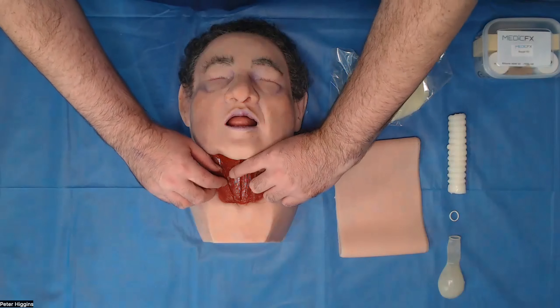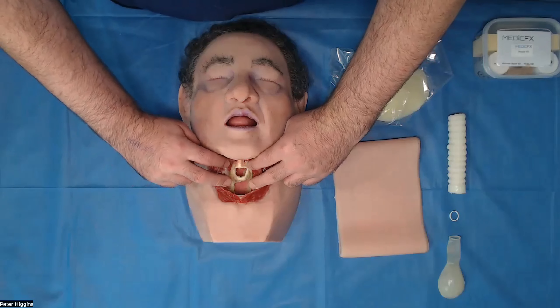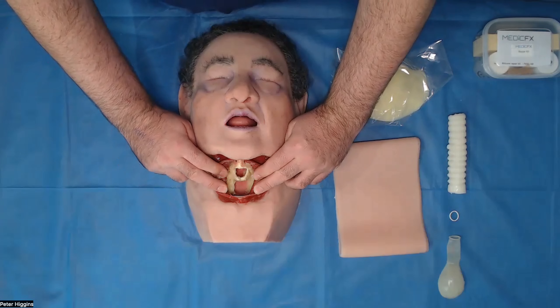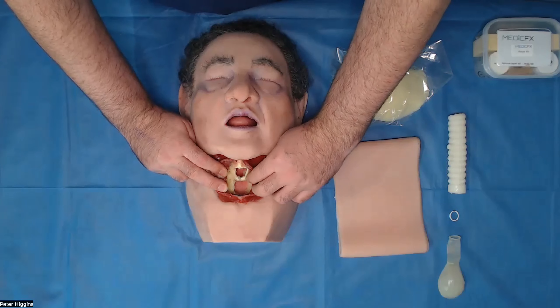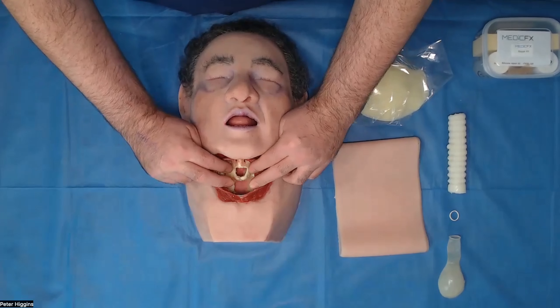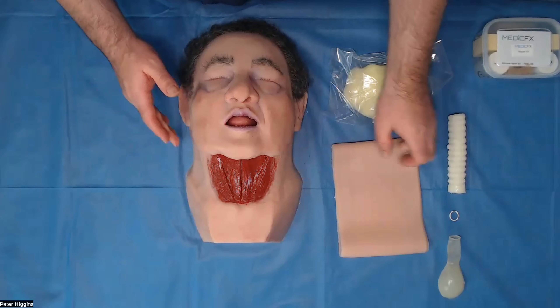I'm going to move on down to the front of neck access part of the model here. As you can see, there's fatty tissue built into the back of the model. There's somewhere for the trachea to rest into. The laryngeal cartilage here is quite firm, quite solid, so you can't put a knife through it, which is good. And obviously, your strap muscles at the front here.